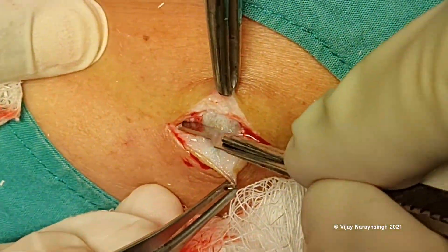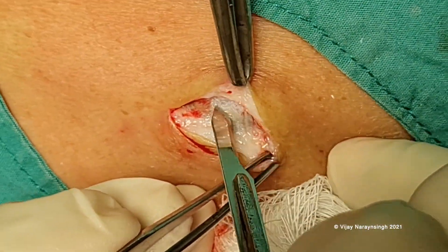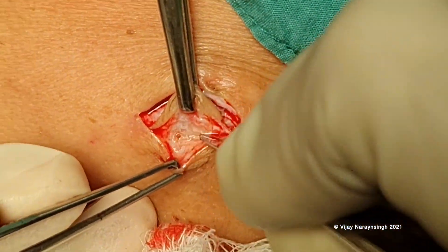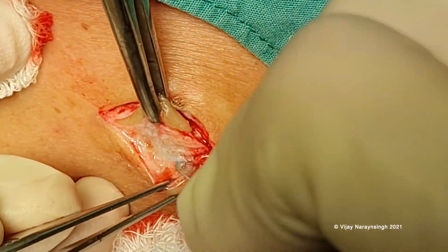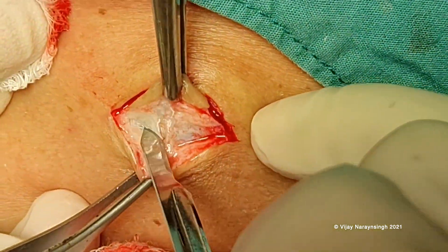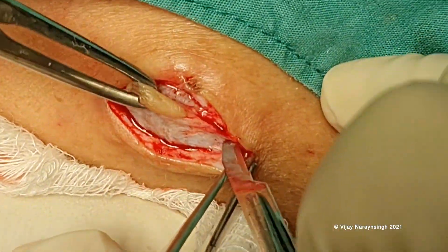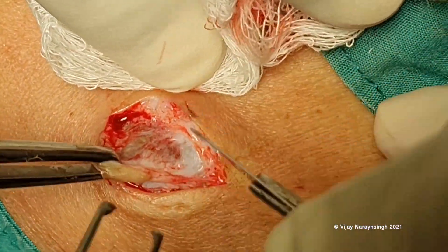So we're going to do a controlled rupture, where we rupture in its superficial part, not in its deep part, because if it ruptures in the deep part, it becomes a very messy operation. Here we are dissecting all around it to get at least nearly halfway down the depth of the cyst. We have to remember the cyst is not always perfectly spherical. This is another consideration in how we dissect the cyst.